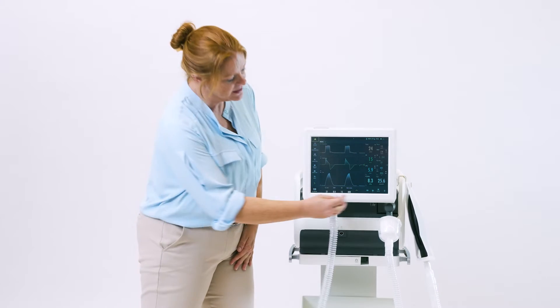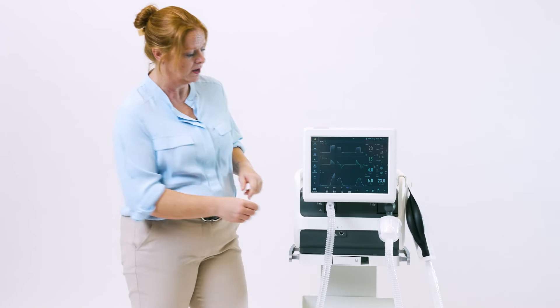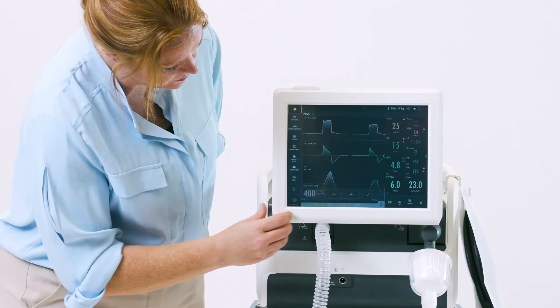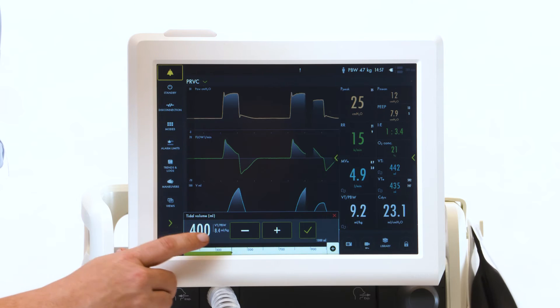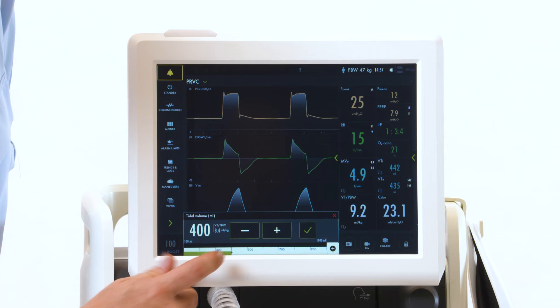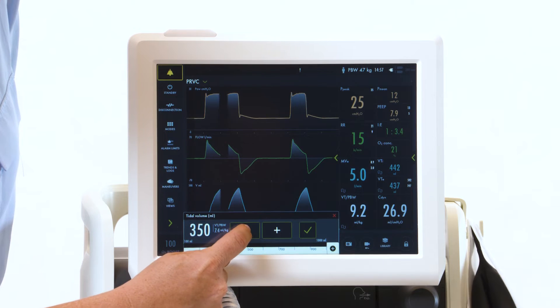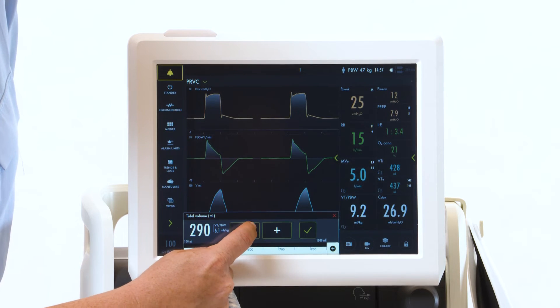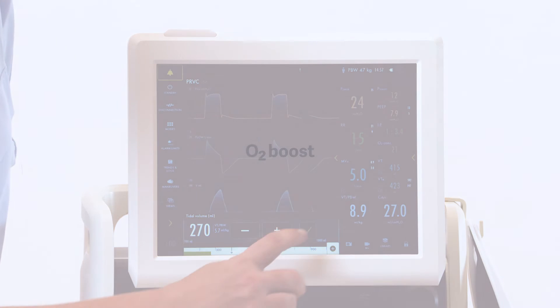Because we put in the patient information at the beginning, the vent will now look at mils per kilo of predicted body weight, breath by breath. This is indicated down here. When adjusting the volume, you'll notice your set volume, followed by mils per kilo. If you'd like to adjust for a lung protective strategy, you may do this here, and then hit your check mark to confirm.